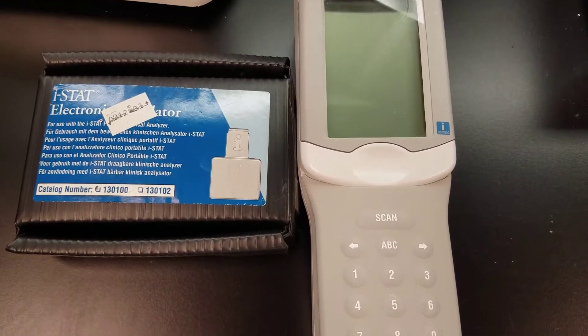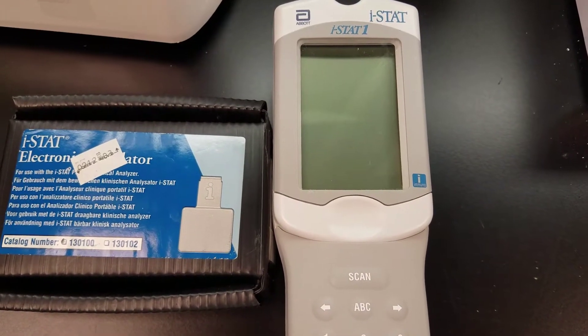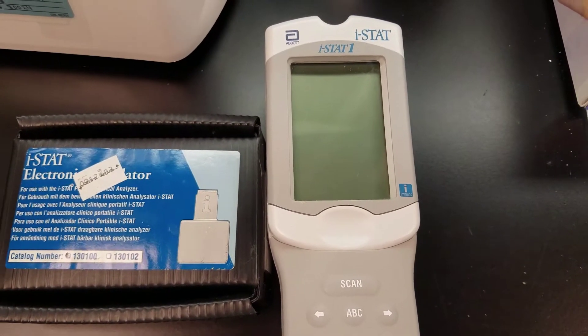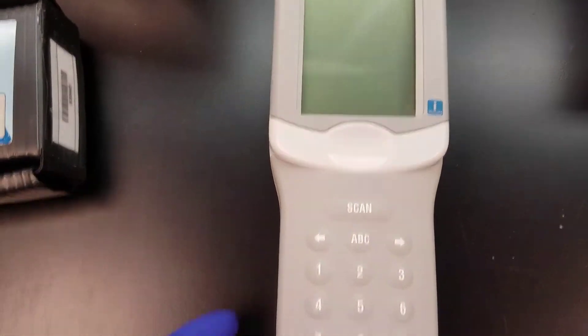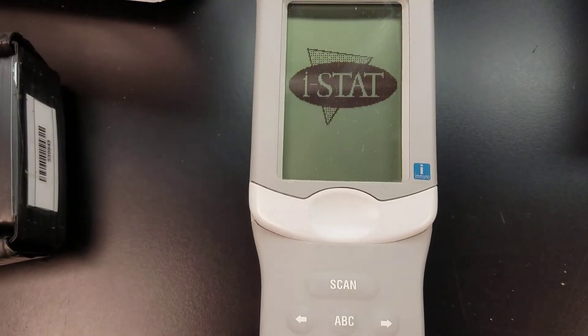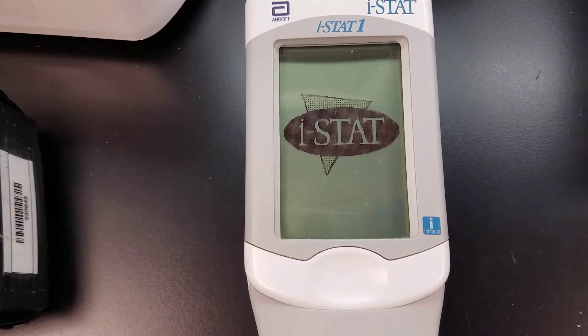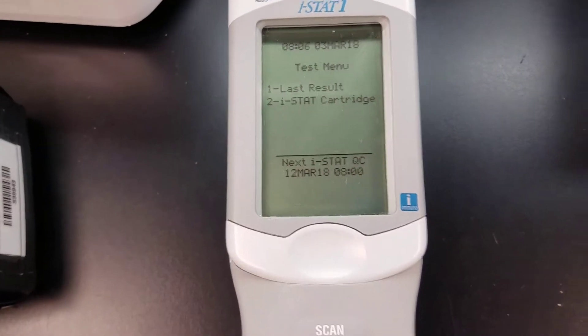Hey guys, it's Mara. In today's video I'm going to show you how to run the electronic simulator on the iStat, which needs to be run monthly — at least that's our protocol. First of all, we're going to turn on the power button and it's going to show that loading iStat screen.